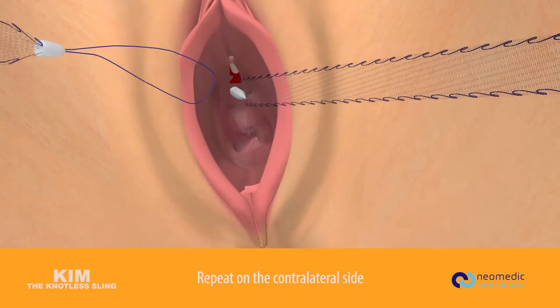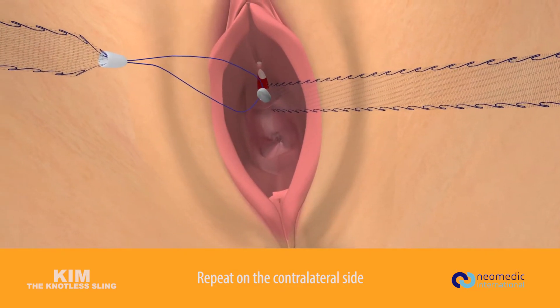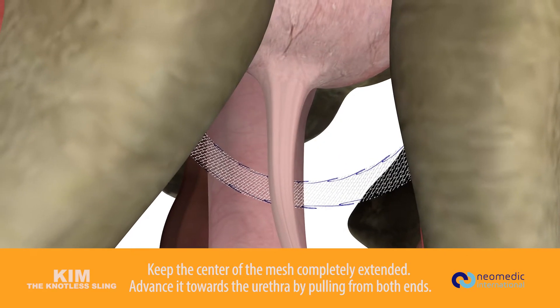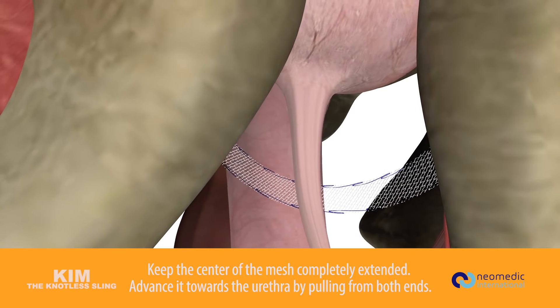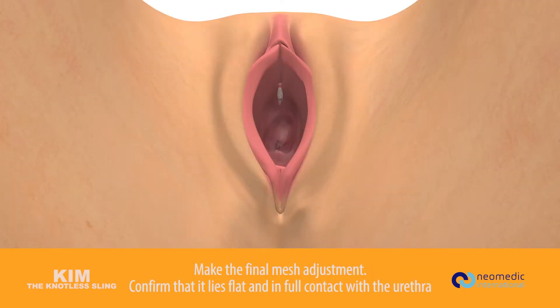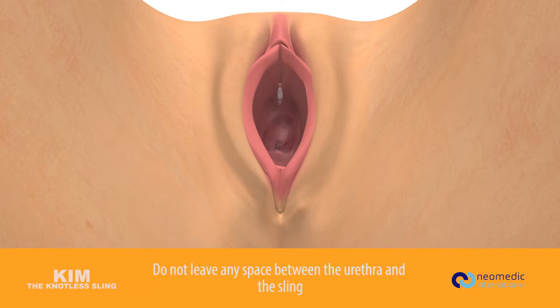Keep the center of the mesh completely extended. Advance it towards the urethra by pulling from both ends. Make the final mesh adjustment and confirm that it lies flat and in full contact with the urethra.